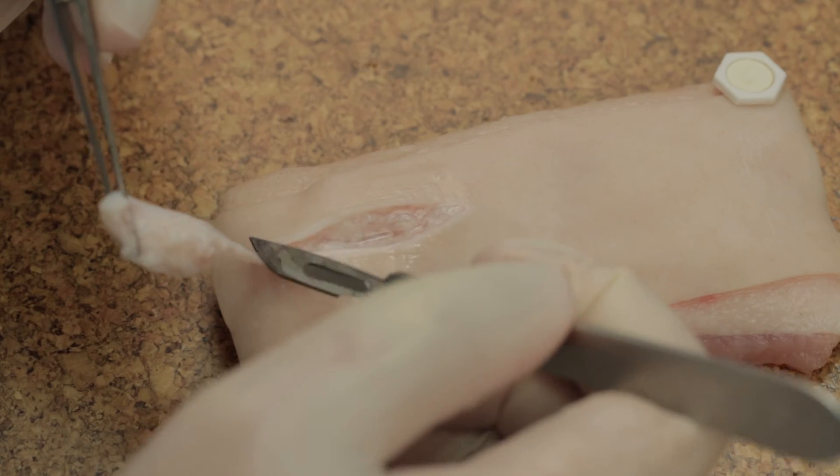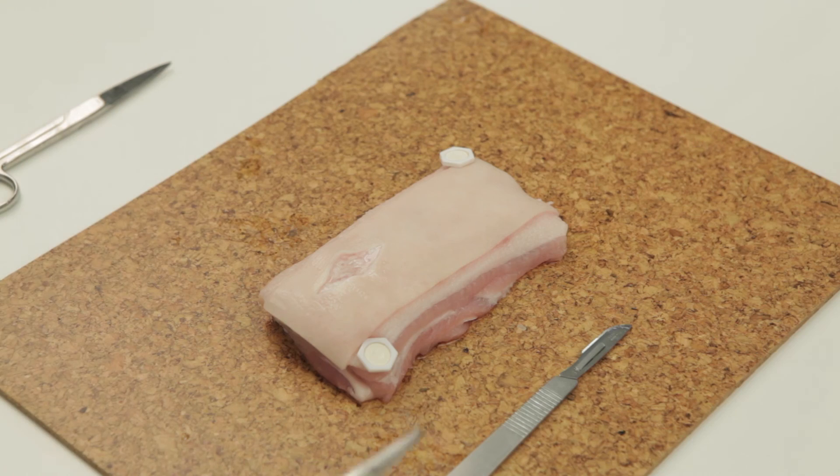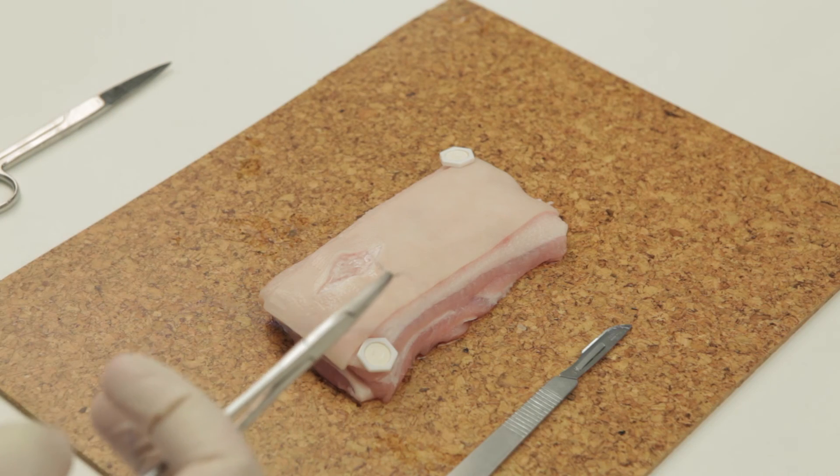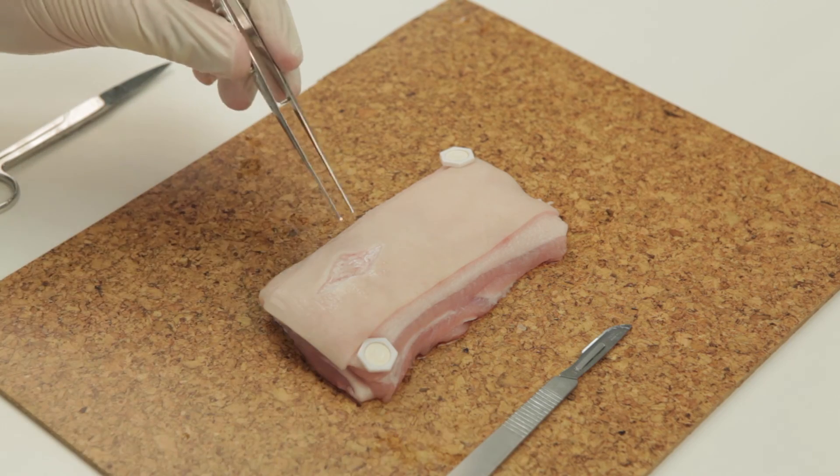The sample can be sent to histology. And finally, the skin should be closed using a mattress suture.